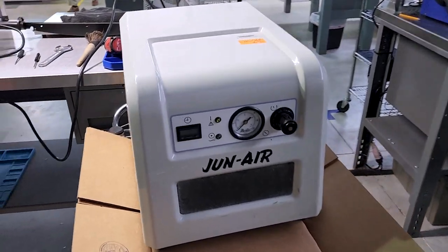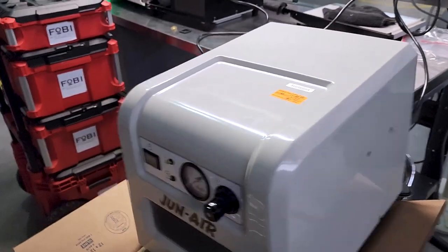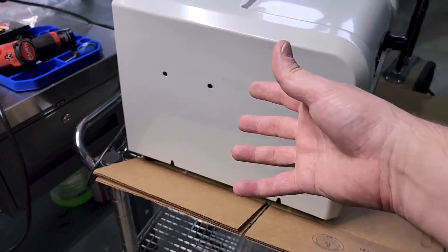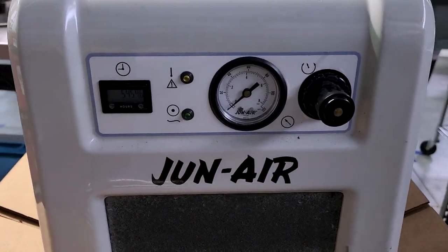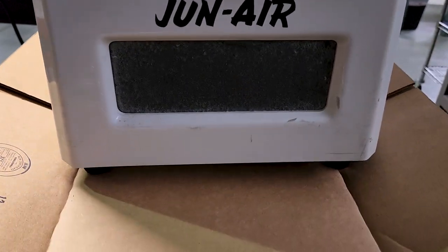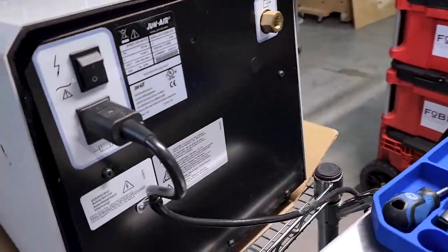All right, guys, this is the Jun-Air UltraQuiet air compressor. And you can see that I have the accessory rails on the side pulled off because that's one of the ways that we're going to pull the lid off. It's a simple air compressor. You have a pressure regulator, a pressure gauge, an hours timer, and your air filter right on the front. On the back, pretty simple.